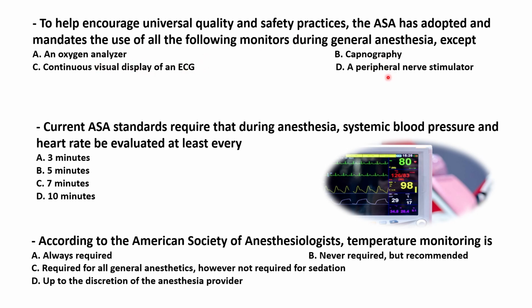A peripheral nerve stimulator: it's not a mandatory device to have in an OT, so this is the answer. But it's recommended to have this device if you are giving muscle relaxant, to know when to start reversing of this muscle relaxant. So it's not a mandatory device, but it's a recommended device.